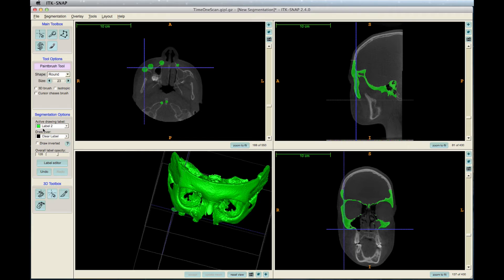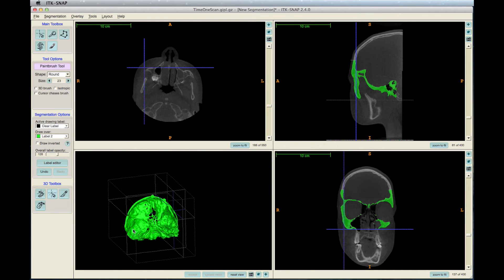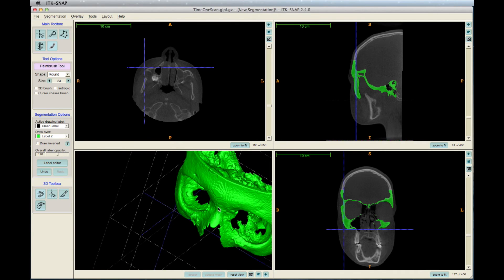When the brush is selected, under Segmentation Options, for Active Drawing Label select Clear Label, and for Draw Over select Label 2, or whichever label you selected in the beginning. Draw over the spots you wish to remove. When finished, click Update Mesh to view your changes — the deformation noise you selected should be erased. Proceed with the same process until all the deformations are gone.